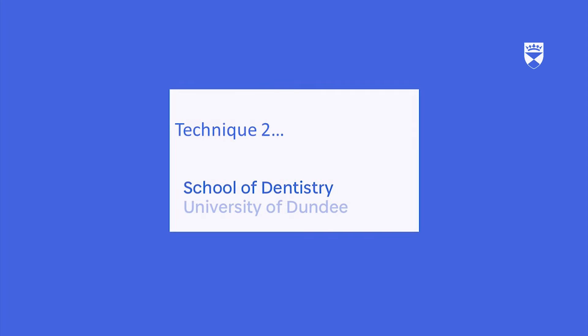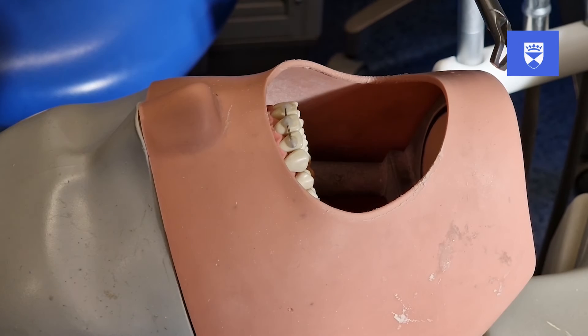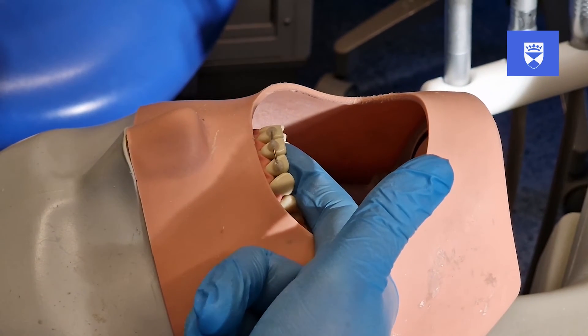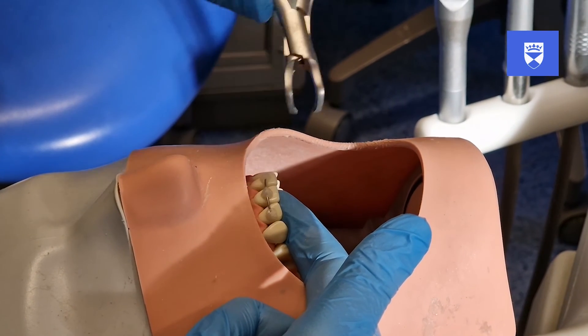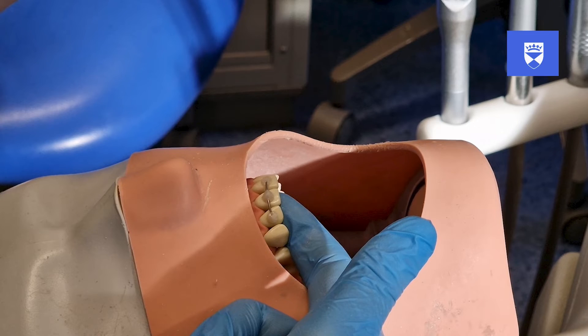Our second technique of splint removal involves the use of orthodontic bracket removers. Similar to method one, release the composite first from the traumatized tooth and assess its mobility. To remove the composite in this method, we use the orthodontic bracket removers in a similar way as you would when removing brackets during a debond process. If the tooth is excessively mobile, as previously discussed, we can re-evaluate the situation and treatment plan accordingly.